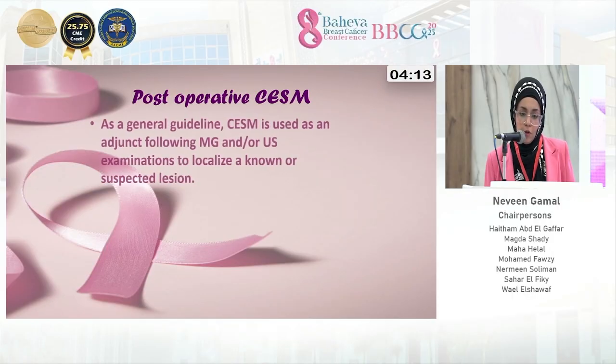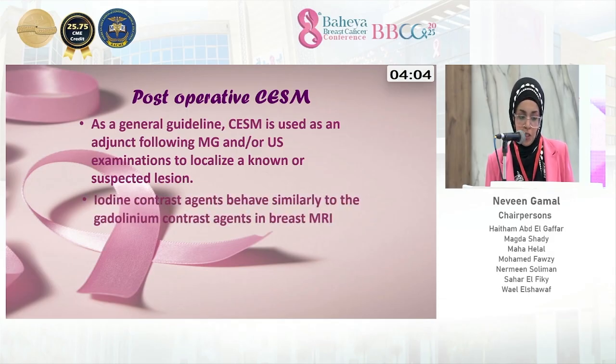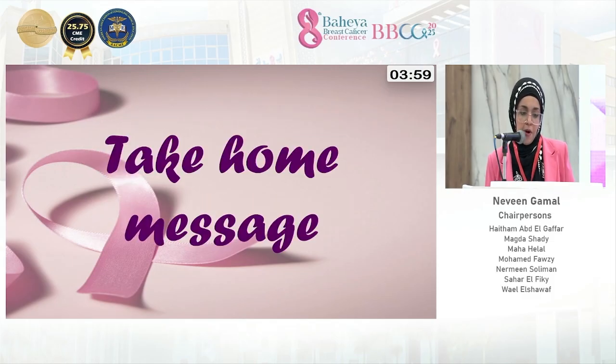And post-operative contrast-enhanced mammography, as a general guideline, is used as an adjunct following mammogram and or ultrasound examination to localize a known or suspected lesion. Iodine contrast agent behaves similarly to the gadolinium contrast in breast MRI.